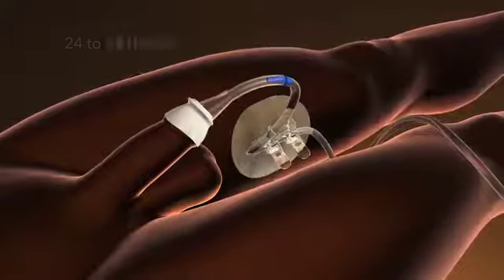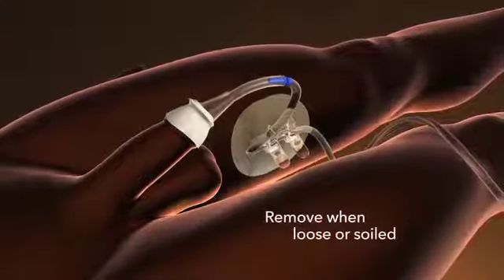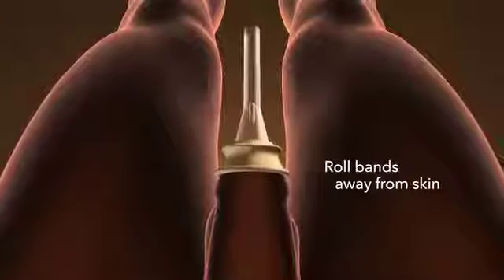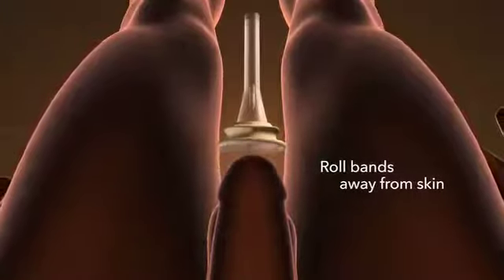Men's Liberty Acute should also be removed if it becomes loose or if it has been soiled. The device can easily be removed by gently rolling the adhesive bands away from the skin.